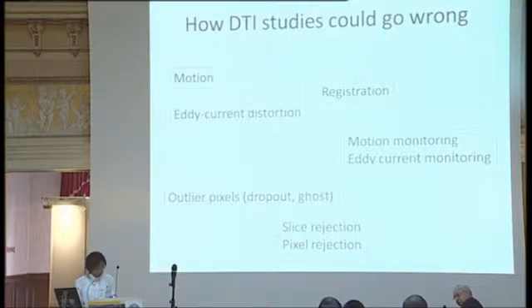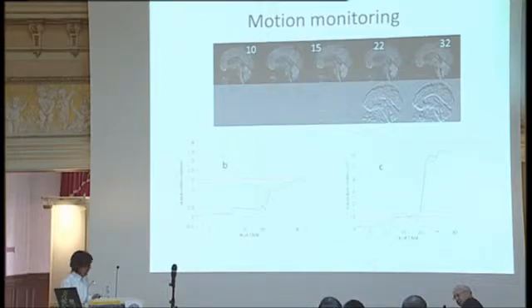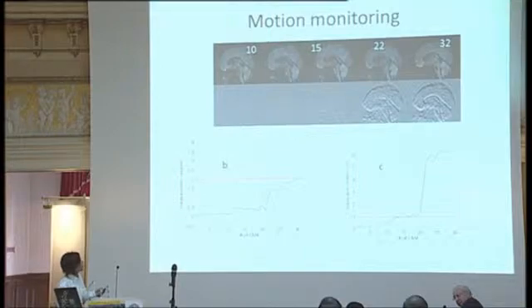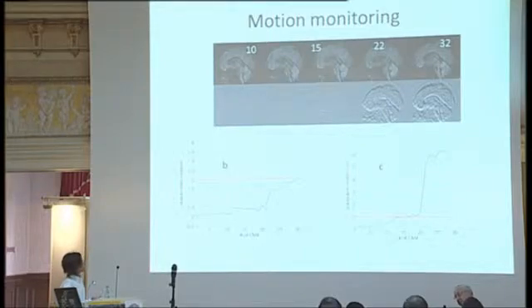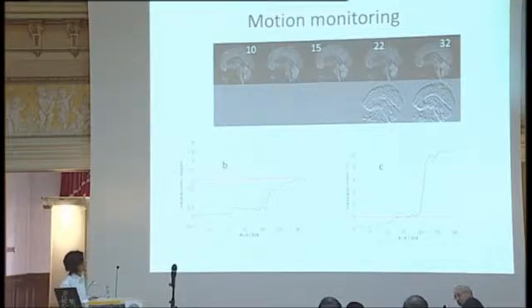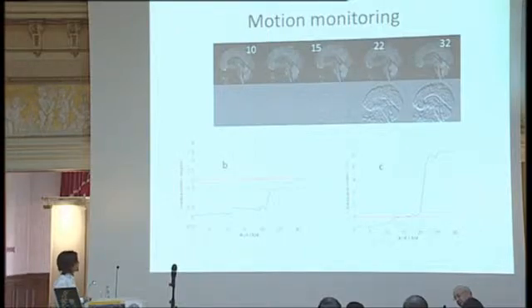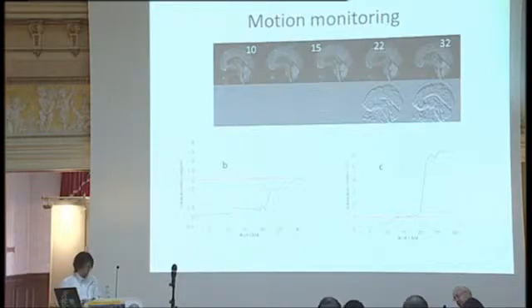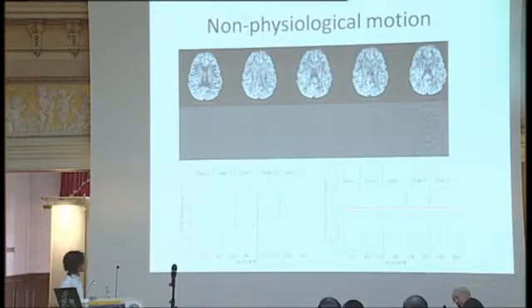Here is a typical case of 32 diffusion orientations — I picked up five of them. This interface shows how the brain moved compared to the data generated from the entire data set. Similar to fMRI studies, it is relatively straightforward to extract the amount of rotation and translation. This is one kind of quality control you would be interested in, and sometimes you can visually see the motion.